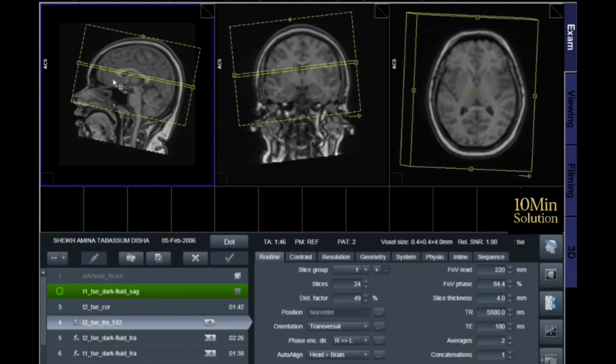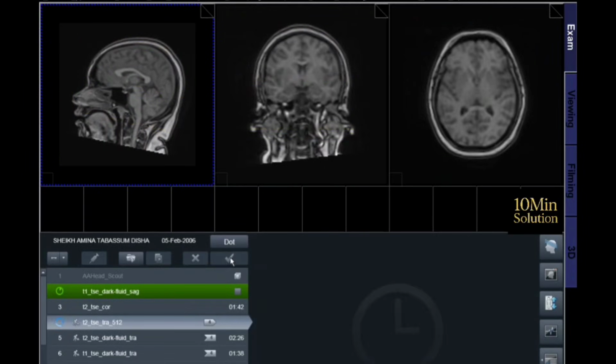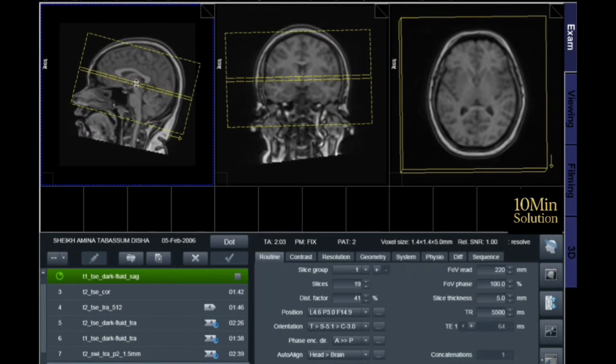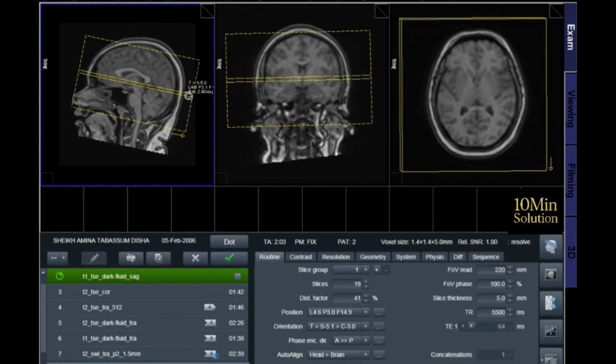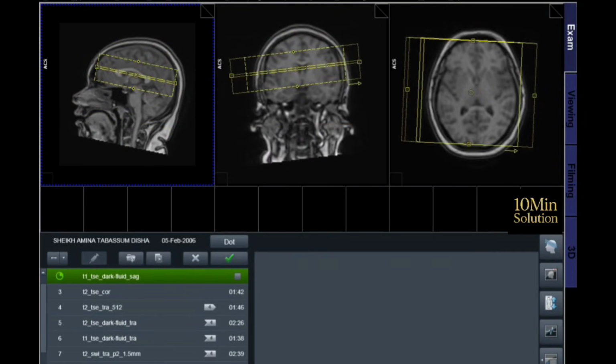The patient should be positioned in the supine position with the head placed in a neutral alignment. Head rotation or tilt should be avoided. A dedicated head coil or a compatible neurovascular coil is typically used. The patient should be instructed to avoid eye movement, as this can cause significant motion artifacts, especially in orbit imaging.